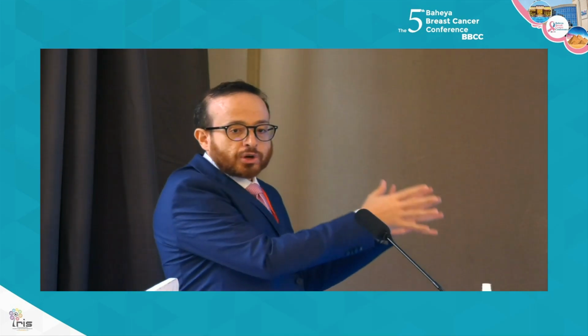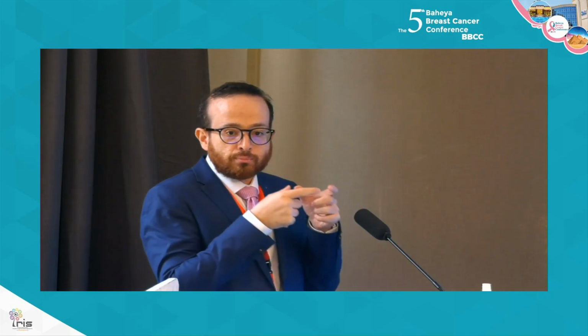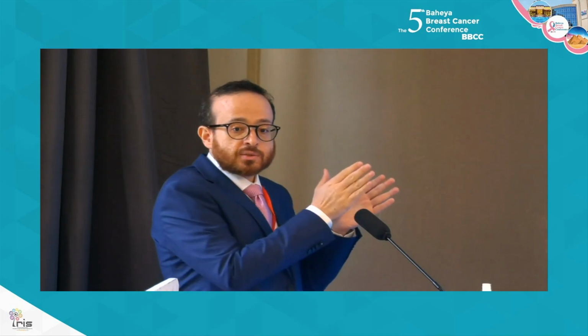I just wanted to ask what's the difference between this multiplex immunofluorescence and the old tissue microarray that we used to do. Is it just that you do immunofluorescence afterwards and it's the same technique? No, the tissue microarray is the construction of a new paraffin block in which I can embed up to 144 cases in just one block. Oh, so that's the process of preparing the block, and then you do the immuno.